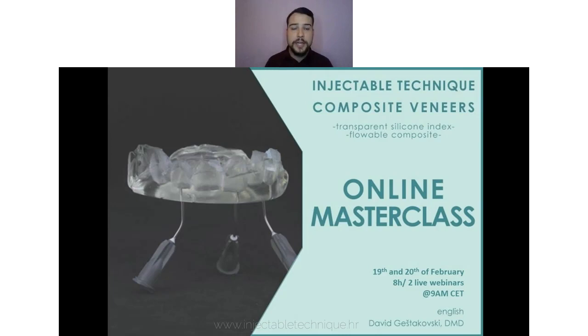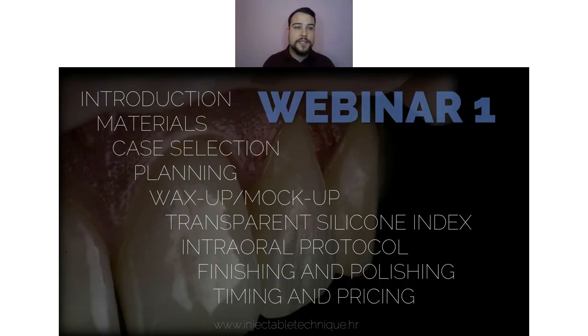The full online masterclass lasts for 8 hours. It has a set of 2 webinars. In the first one, we have the introductory part. We speak about the literature and the scientific base of using some specific flowable composite for this purpose. We describe different materials which can be used for this technique, how to choose transparent silicone, and how to make a transparent silicone index.